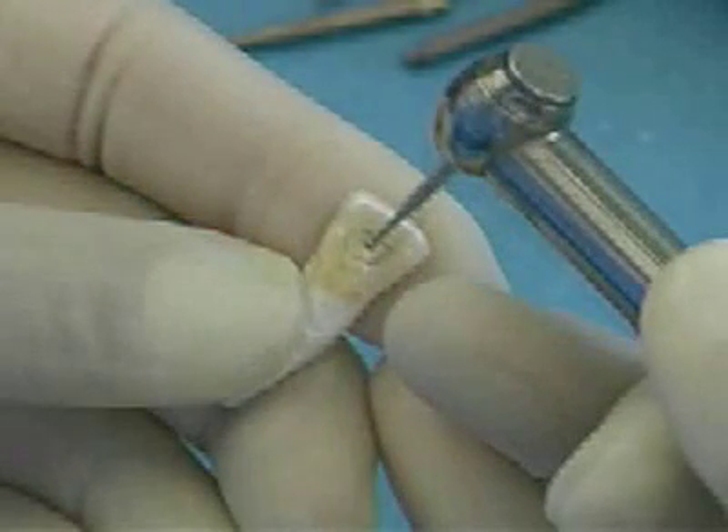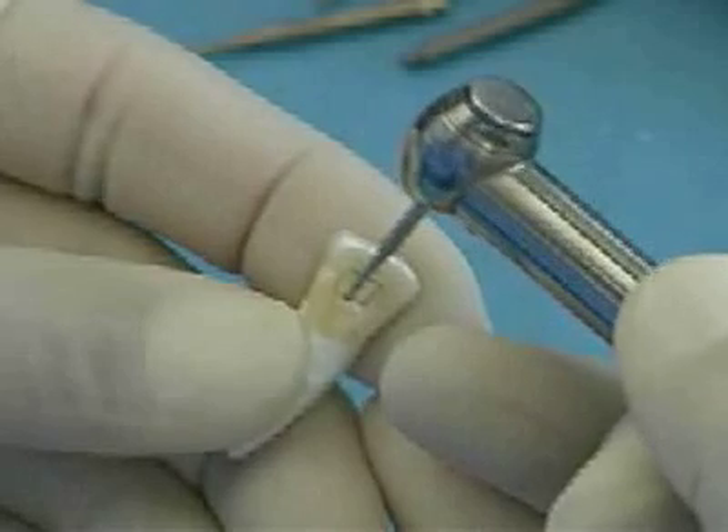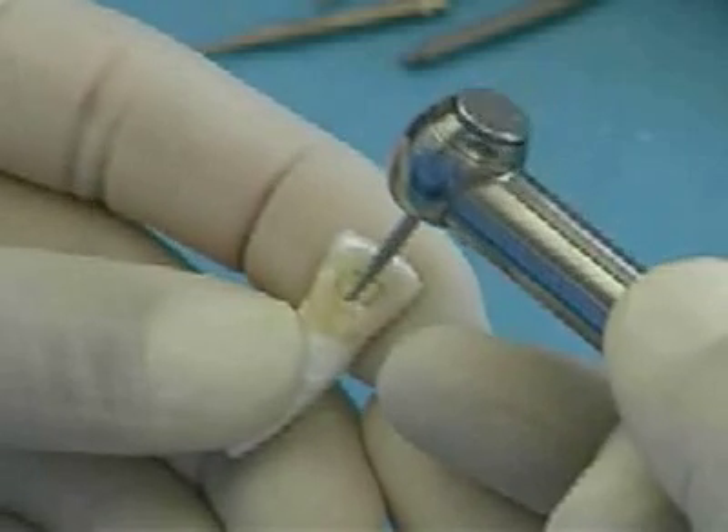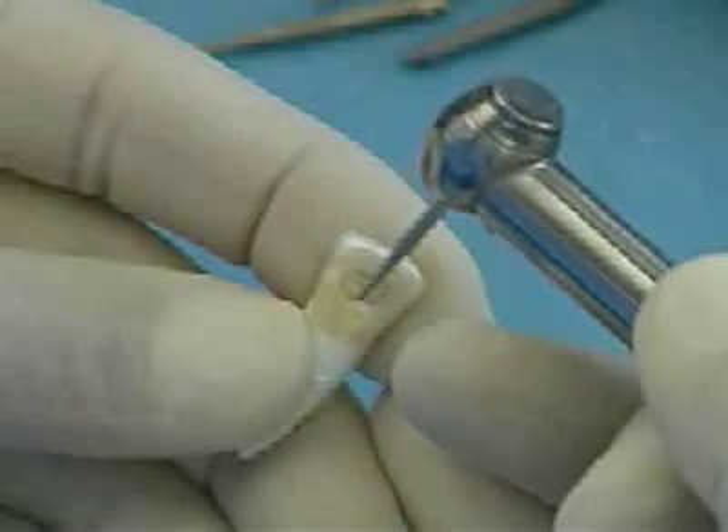Extend the opening laterally to the designated outline by maintaining the point of the burr in the central cavity and rotating the handpiece toward the incisal so that the burr continues to parallel the long axis of the tooth.